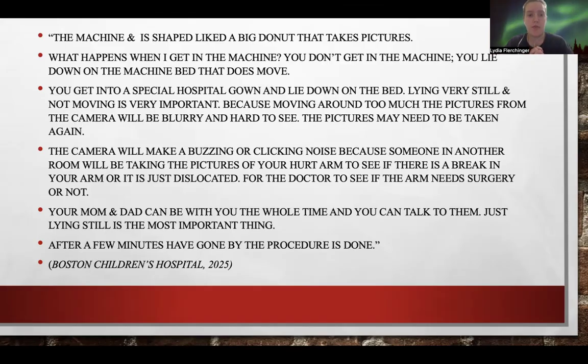The camera starts making buzzing noises, because that means they're taking pictures. The pictures or the noises will not hurt you. It just makes sure that they can see throughout your entire body, so they can find anything that may need surgery or looks not normal, and make sure that you're okay.